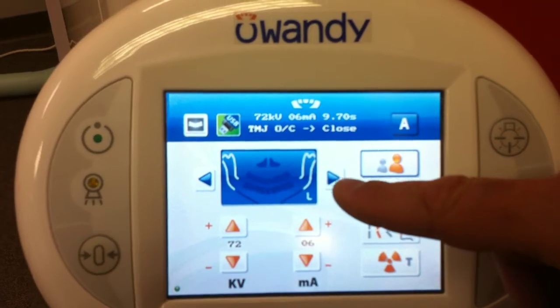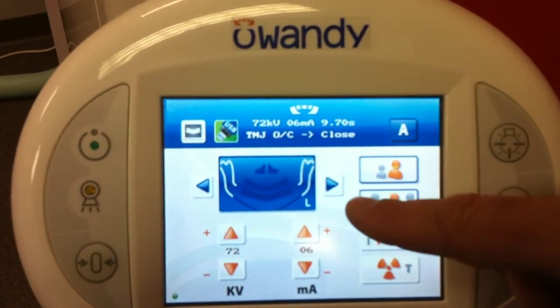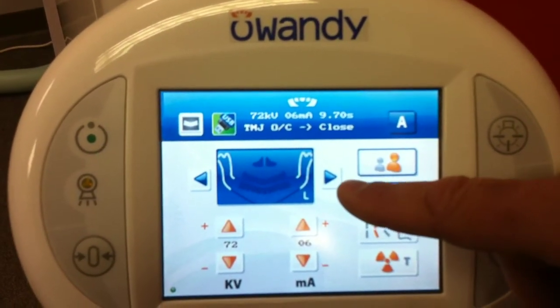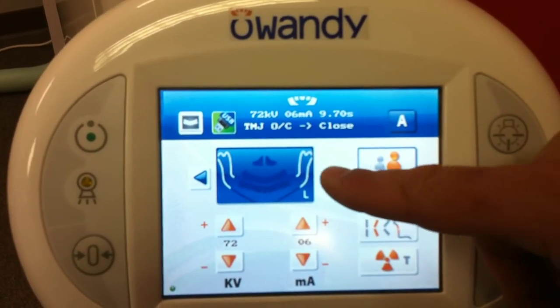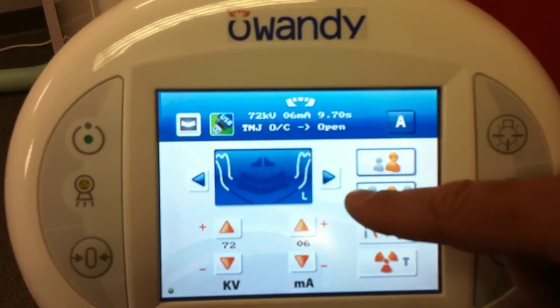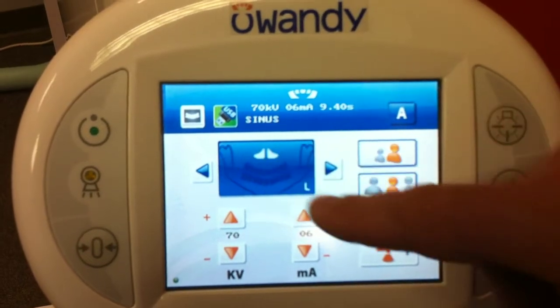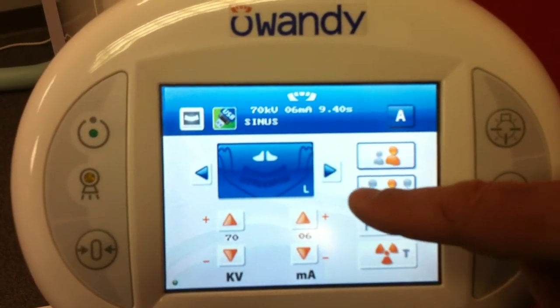The next mode is the TMJ. You have the selection of either close or open. The next mode would be the sinus.